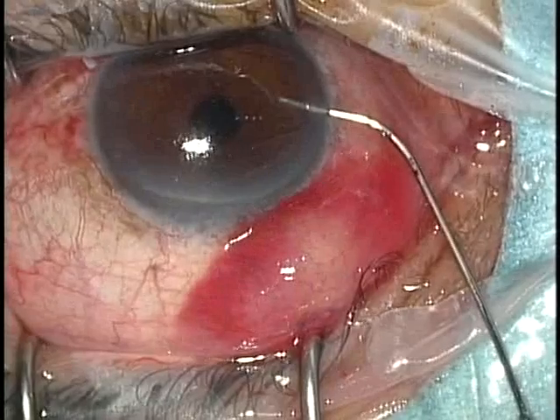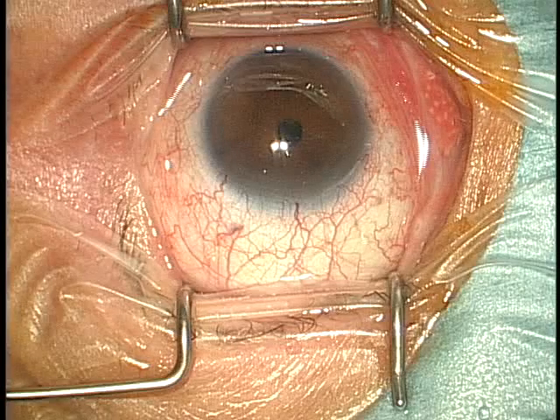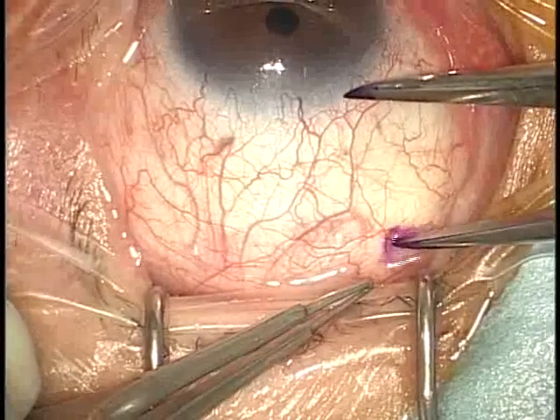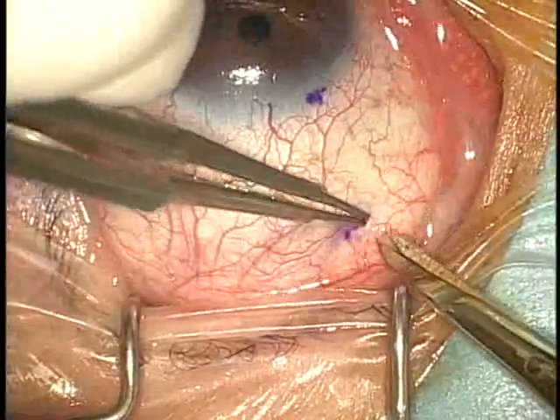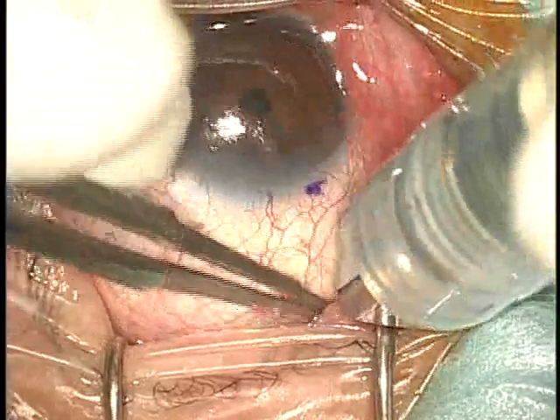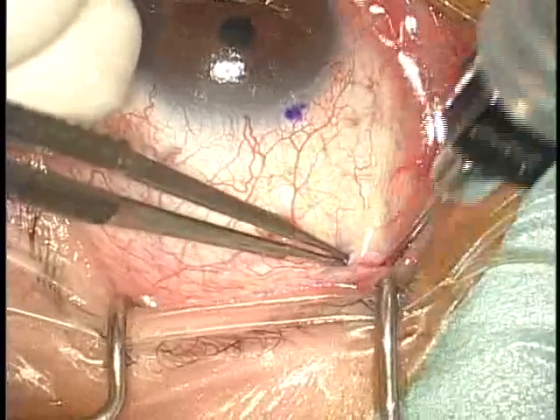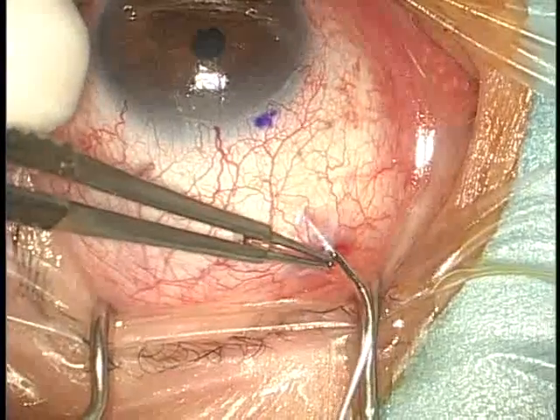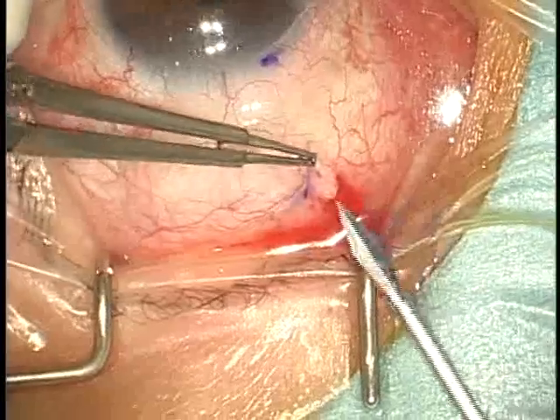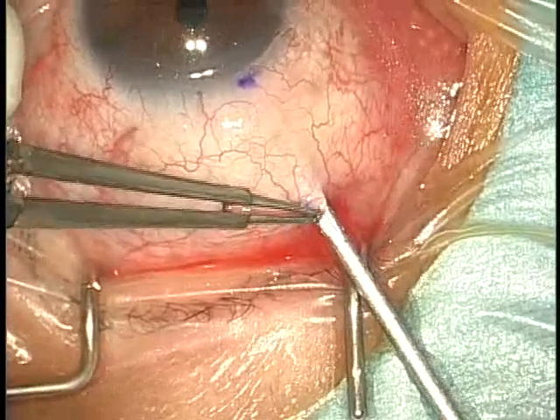Intraocular pressure is monitored by finger on the globe. In the second case, I demonstrate a 1mm trabeculectomy. Each step of the surgical technique is almost the same. First, I make a 1mm incision at 8mm from the limbus. Subtenon's pinpoint anesthesia is performed to block the ciliary nerve. Next, I inject a mixture of mitomycin C and 2% xylocaine into the subconjunctival space.